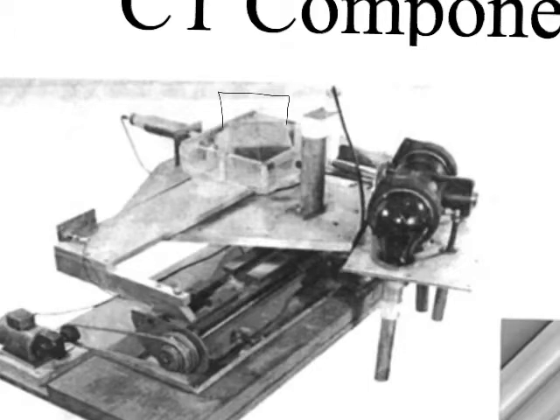In the place of the turntable, he used a lathe, right? And so this is just a thing that turns things around, right? And so we can see the mechanisms that are turning things around down in here and stuff, right? But it's turning this cow brain around in this direction, right? It's going to just rotate that cow brain around. And he didn't actually use X-rays for the first radiation source. He used americium, which is a radioactive element, right? He used a radioactive element, americium.